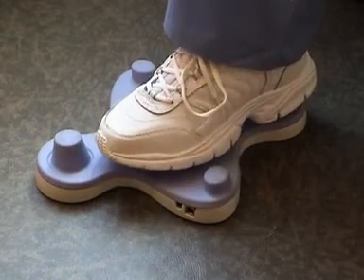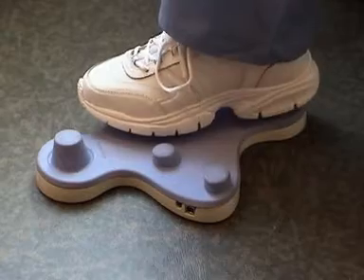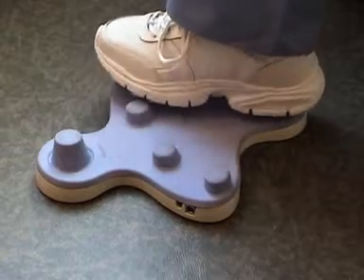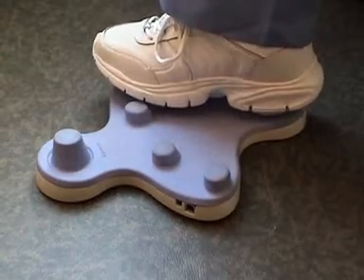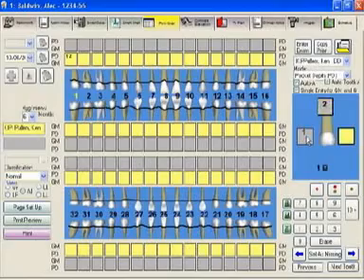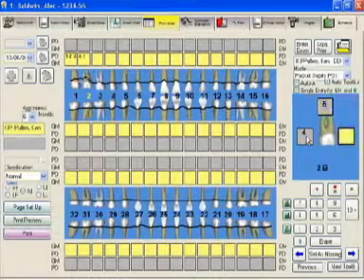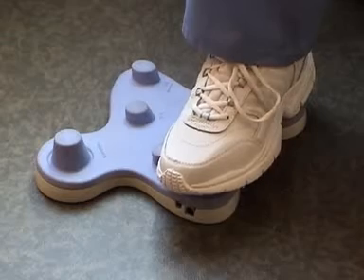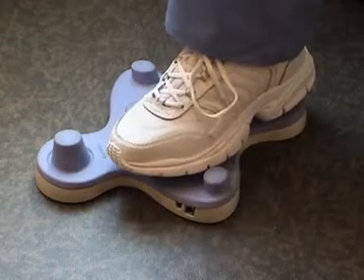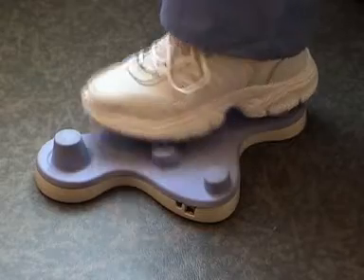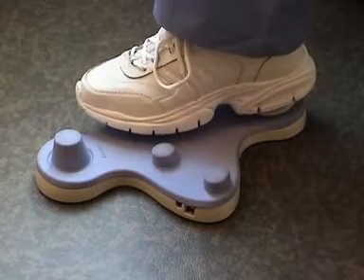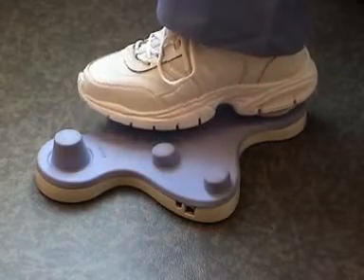One, two, three, four. And if you hold the numbers down for over a second they become five, two becomes six, three becomes seven, and four becomes eight.